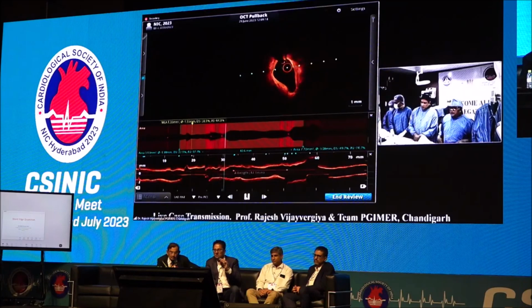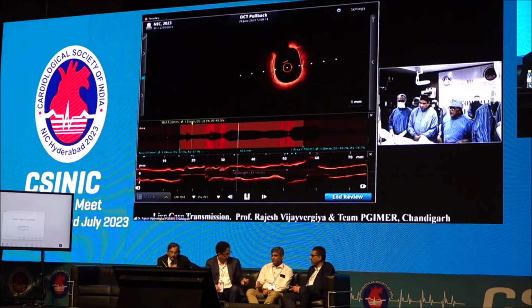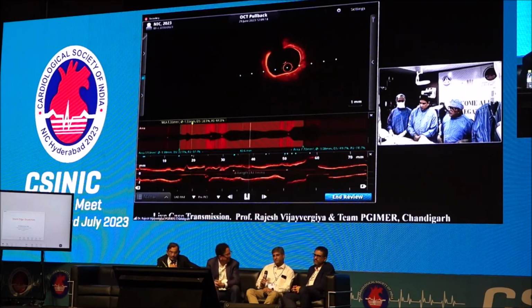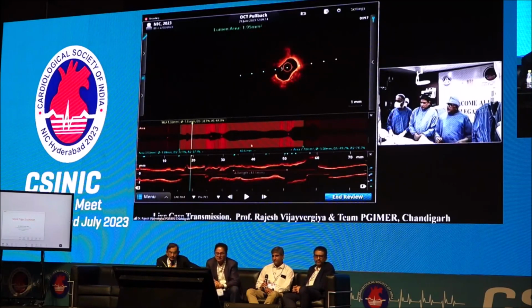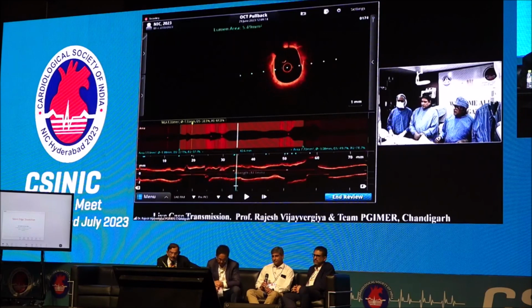Let's go ahead and discuss how to proceed further. Meanwhile, as it is a calcified lesion across the LAD, a 360-degree arc of calcification is there, which can be very well appreciated. Minimal luminal area. Can you demonstrate, Nikhil, what's the minimal luminal area? It's 1.95 in the mid-LAD. Proximally, the LAD is very much calcified with the area on the lower side. And of course the left main, which is diseased.